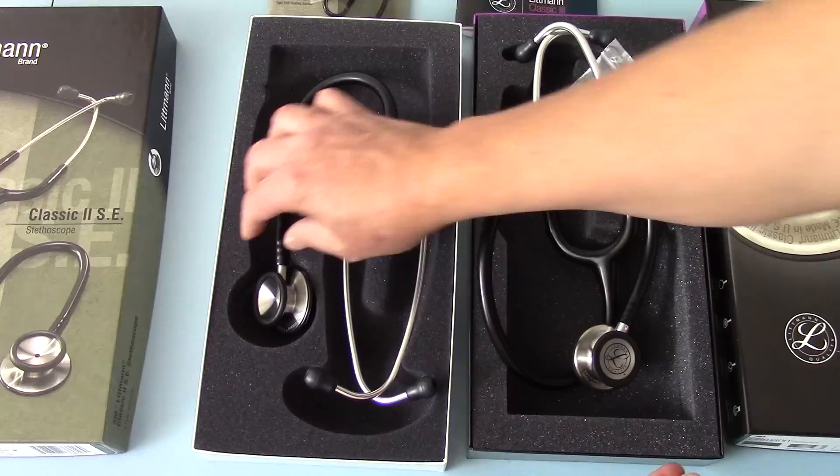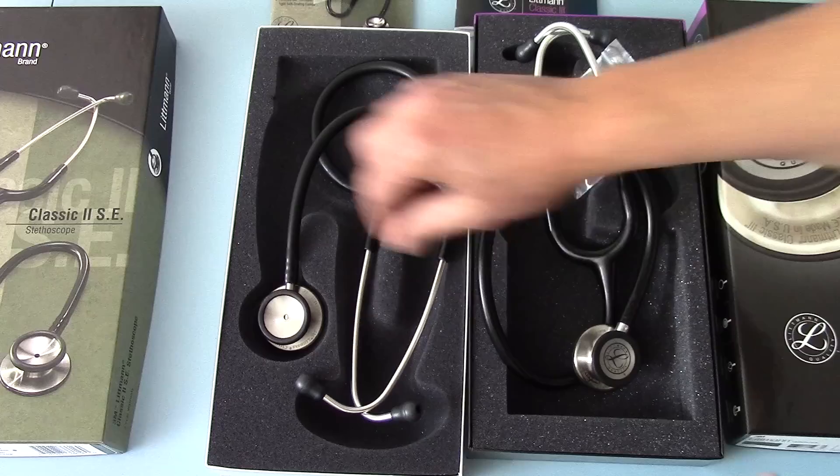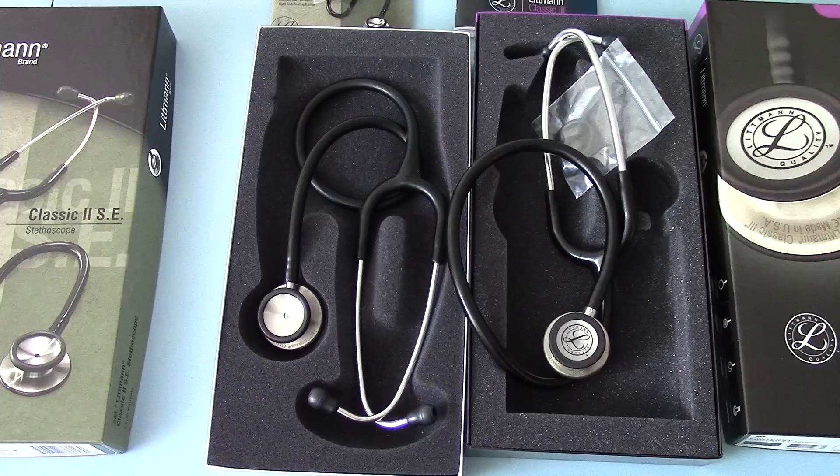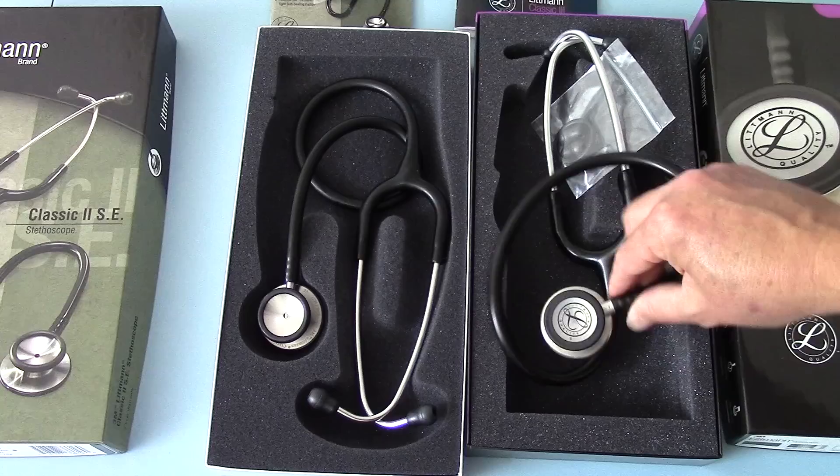Rotation on the Classic III is very nice and precise with a good lock, though that's always been the case with the Classic II SE as well. The lumen of the connectors between the tube and the chest piece is wider on the Classic III, which I think is an improvement. It feels more robust in its manufacture, and the attachment of the tube to the chest piece through the internal mechanism is also more robust on the Classic III.